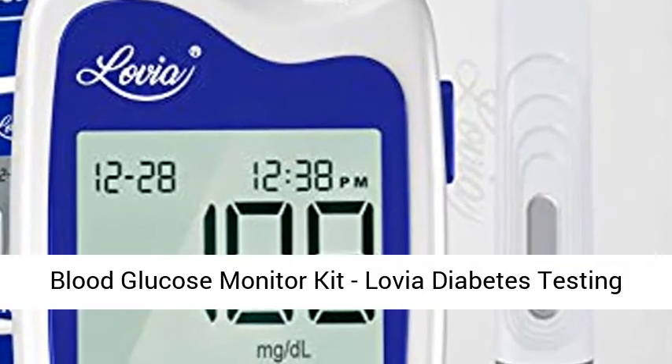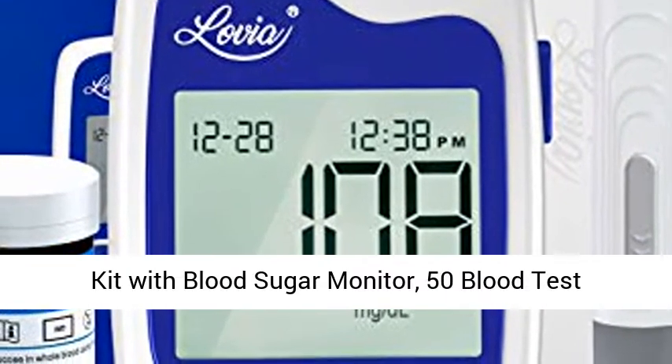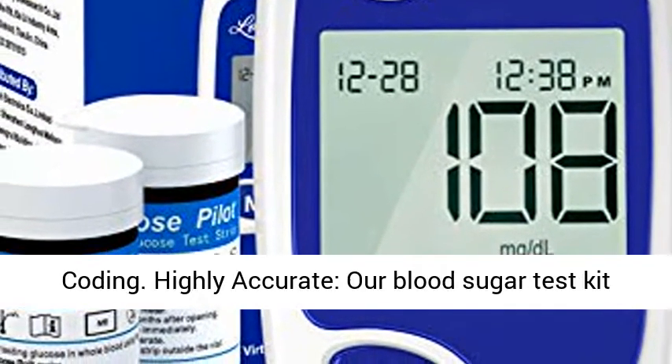Blood glucose monitor kit — a diabetes testing kit with blood sugar monitor, 50 blood test strips, 50 lancets, lancing device and carrying case. Glucose monitoring kit with strips, no coding.